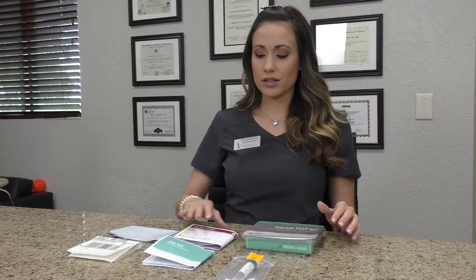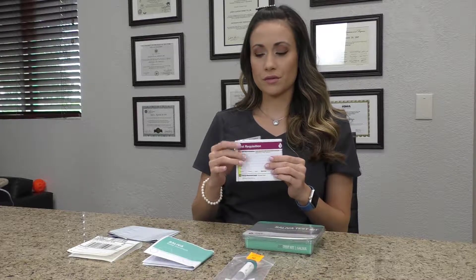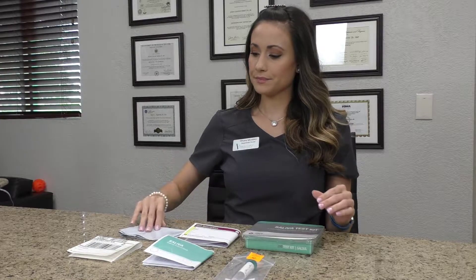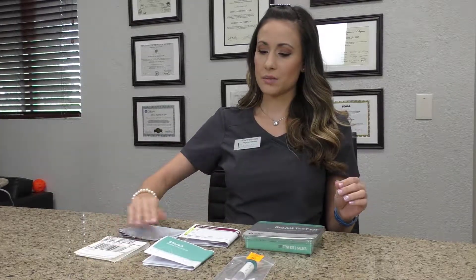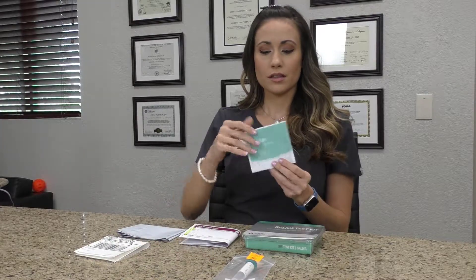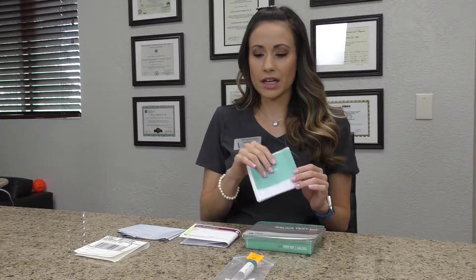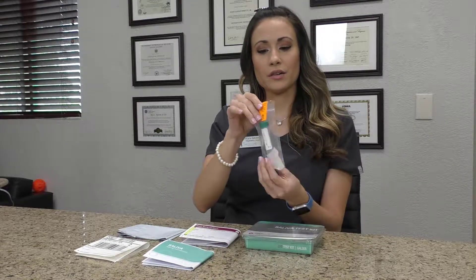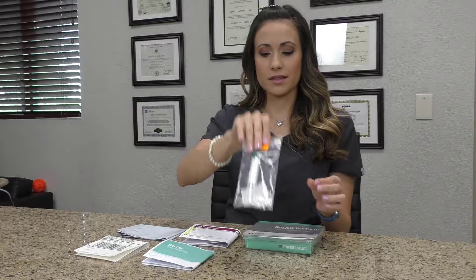Inside your kit you're going to have a requisition form, a bag that you're going to put the kit inside, your label which will be dropped off at UPS, instructions just in case you forget how to take the sample, and a bag with a tube inside which is where you will spit.